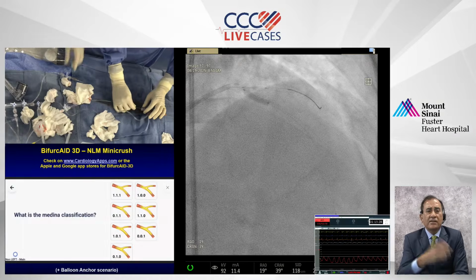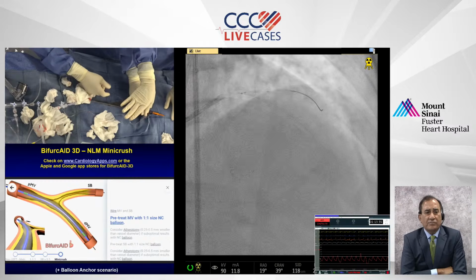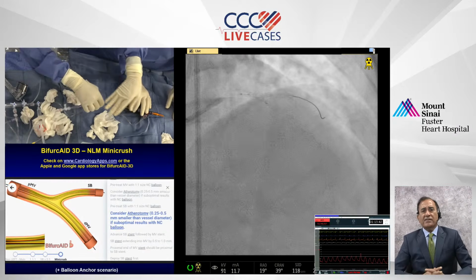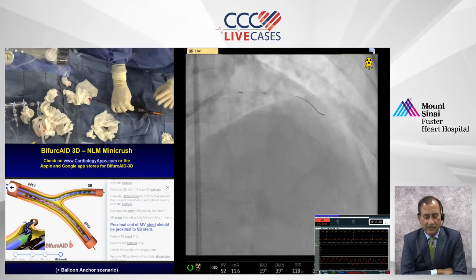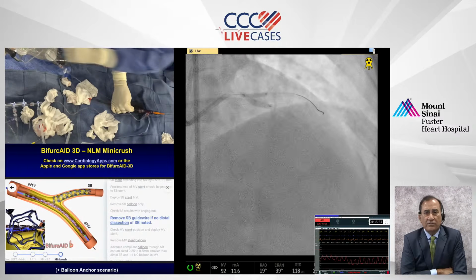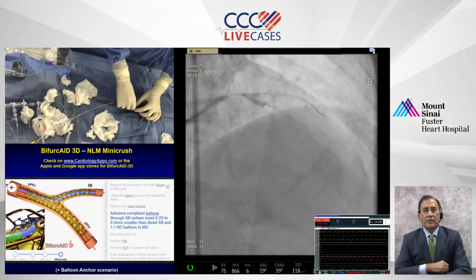This is a low-profit business for the stents. Stents have been the same. What I meant, not doing a new technology, not going further. By this time we would have had all sorts of AI-guided stent development, and I think it's lagging so far behind, just because there is no profitability there. You make the best stent and it sells for $180. That's it.